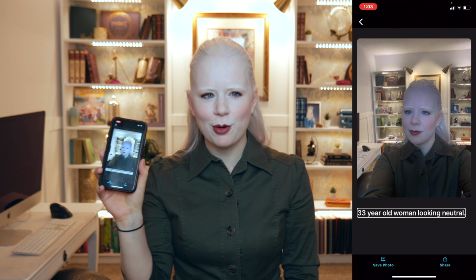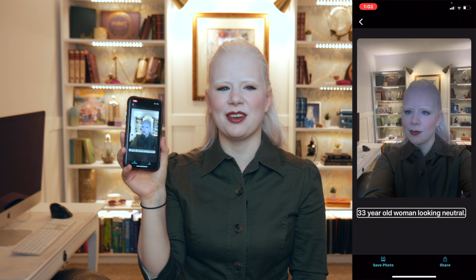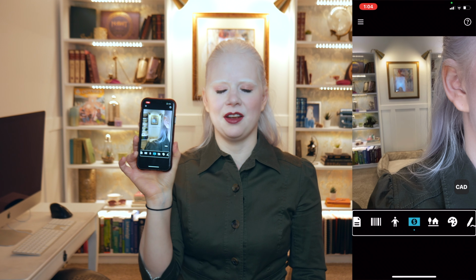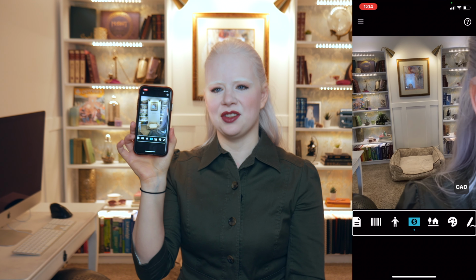It's off by about 4 years, but I think it's pretty fun that it's so close to being accurate to actual age. In our next section, Currency. it has a currency identifier. From the channel menu, if you swipe left, you can change the currency that it's going to identify.